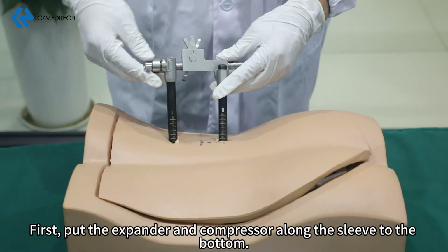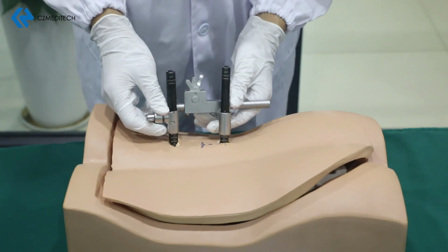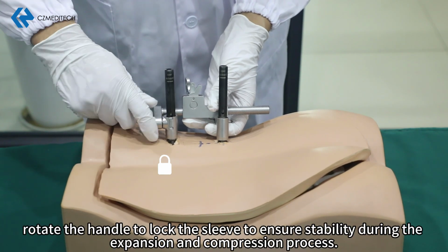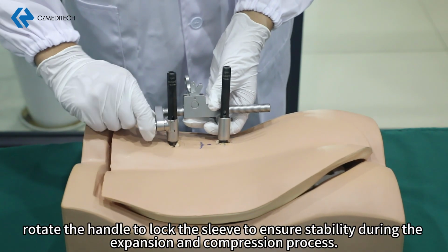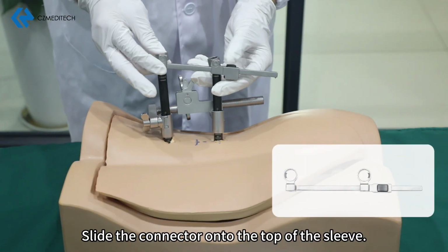First, put the expander and compressor along the sleeve to the bottom. On one side of the fixed end, rotate the handle to lock the sleeve to ensure stability during the expansion and compression process. Slide the connector onto the top of the sleeve.